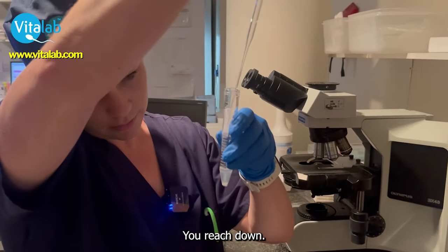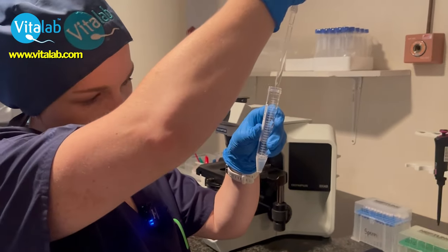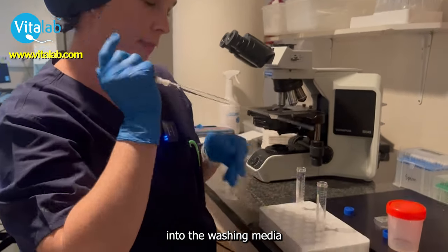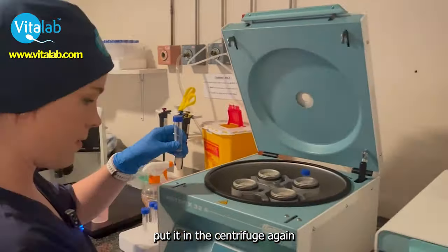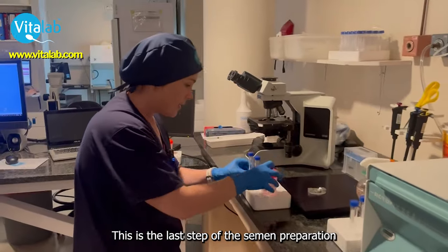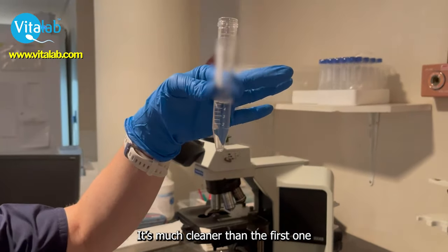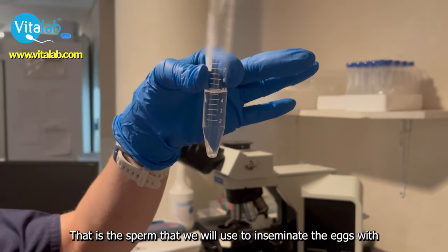I'm going to put it in the centrifuge again. This is the last step of the semen preparation on the day. As you can see here, this is our final sperm — it's much cleaner than the first one. And what we want is the pellet there at the bottom. That is the sperm that we will use to inseminate the eggs with.